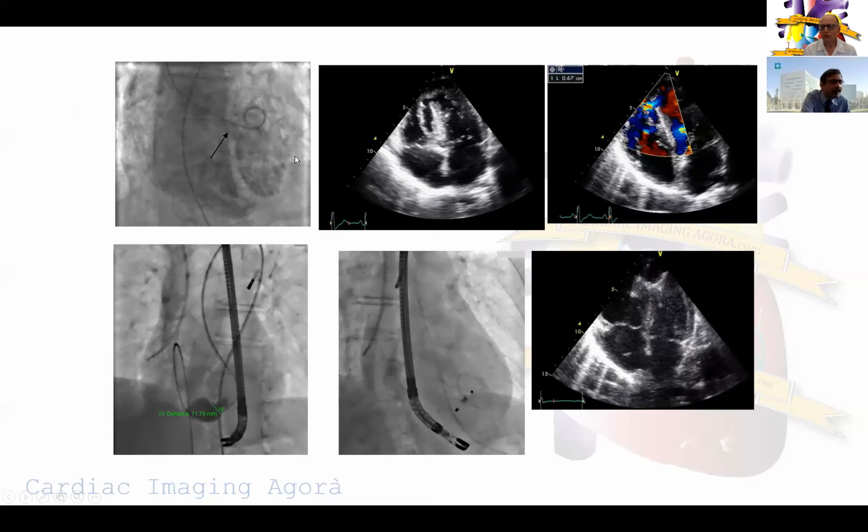Sometimes when we have cases like that, we now shift to using transcatheter devices, either in a palliative fashion or with a hope to try to buy ourselves some time and bridge the patients to definitive repair. So that's another unique use of echocardiography.